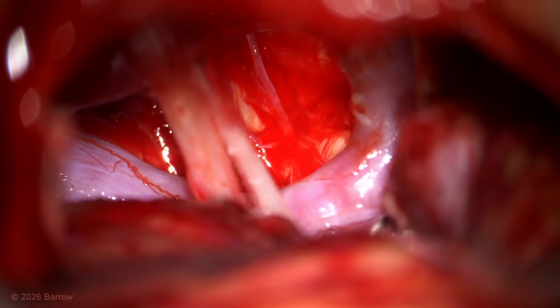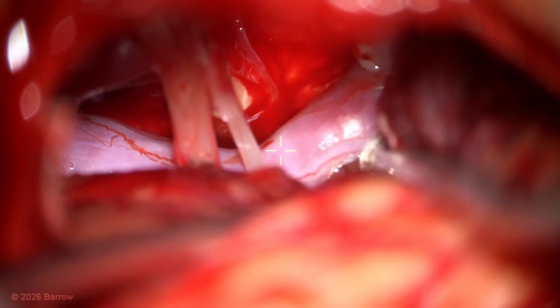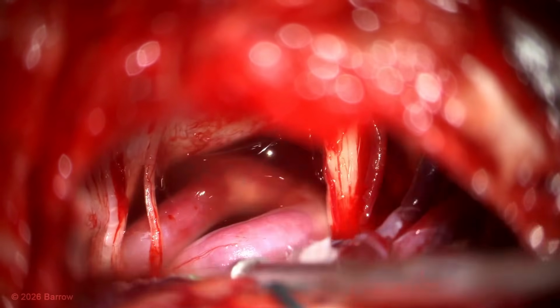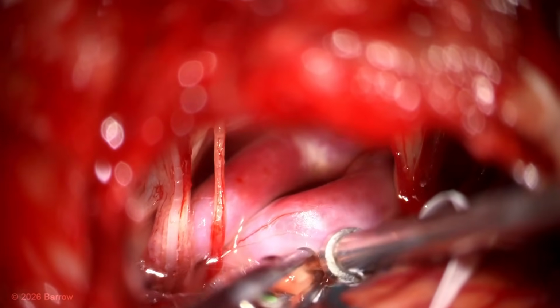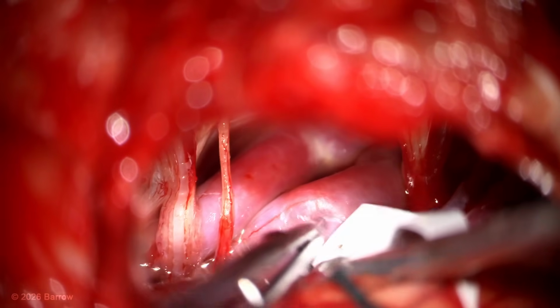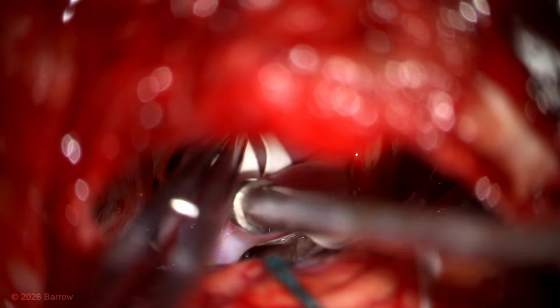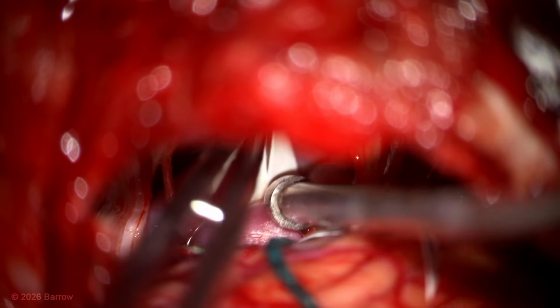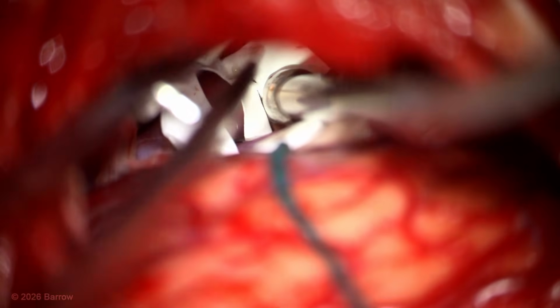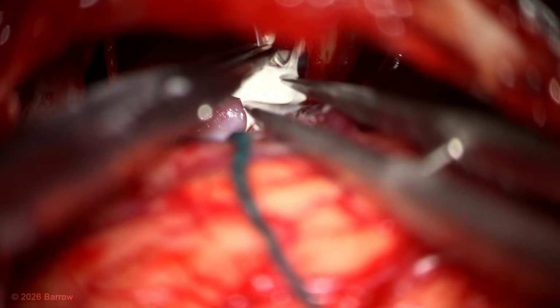Here now that loop of the V4 segment is pulled forward. This releases it from its knuckling into the pons. I've placed a cottonoid behind it to hold it forward. Now I can slide a sleeve of Gore-Tex around this V4 segment. I'm passing the slit end first, which you can see here now wrapped around the artery. I've cut a small pointed end on the opposite side, which is fed through the slit. By passing it through, we form this lasso that grabs the vertebral artery.